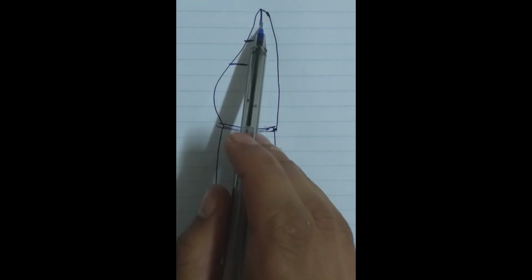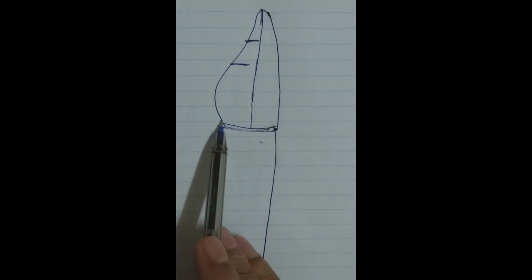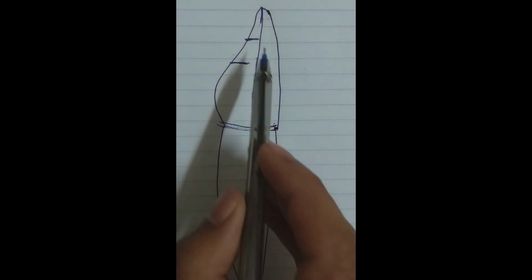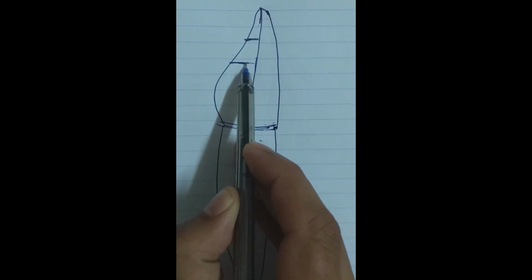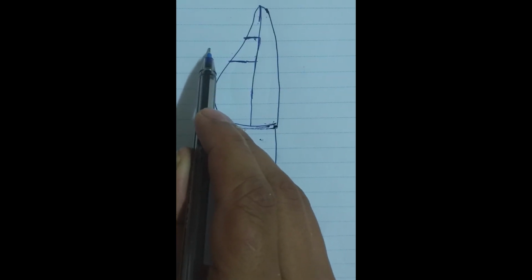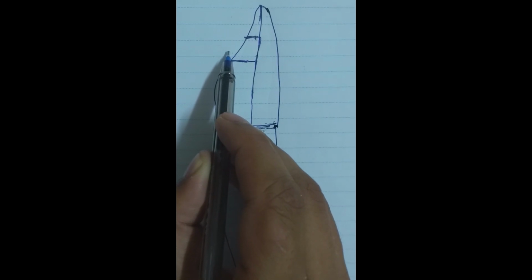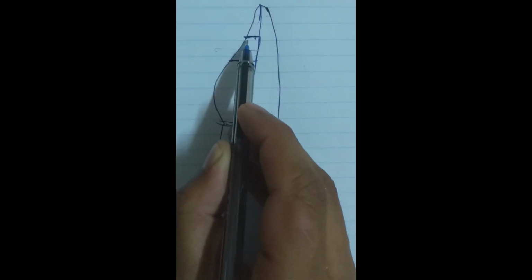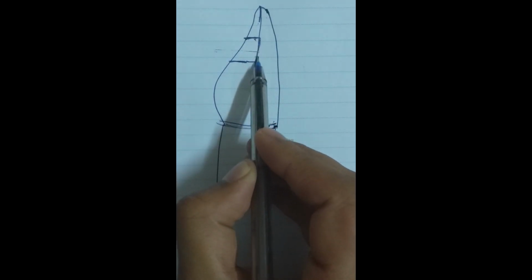This part from here is equal to this, and this equal to this. This is not equal to this, obviously, but this is the line in the contact between the adjacent tooth. We will enter into it with our preparation from here. We will extend by the fissure or by inverted or round bur from here facially until we reach this area.